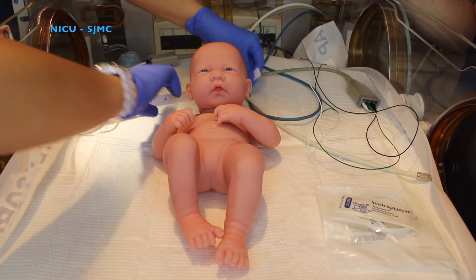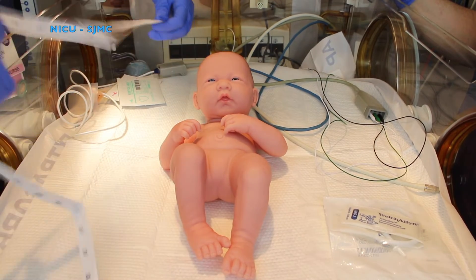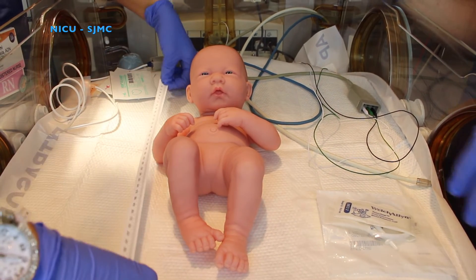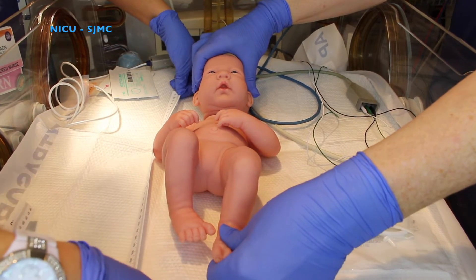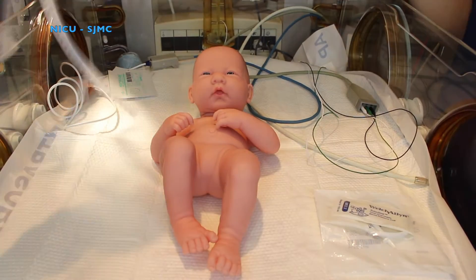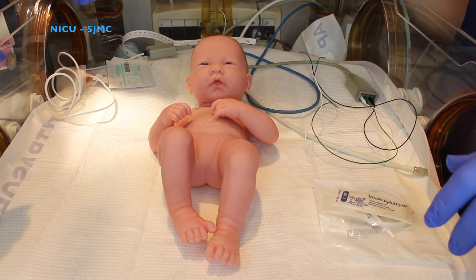Next, you will measure your baby's head circumference — 31.5 cm — followed by a length. For demonstration purposes we are using a doll; a real baby will flex its leg. And we've got 38 cm. Call your measurements out to your partner as they will write them down and record them for you.